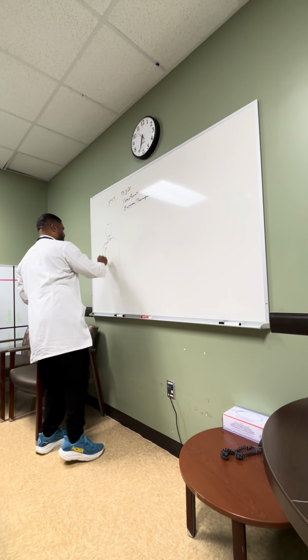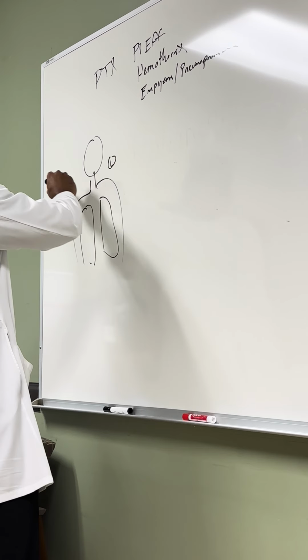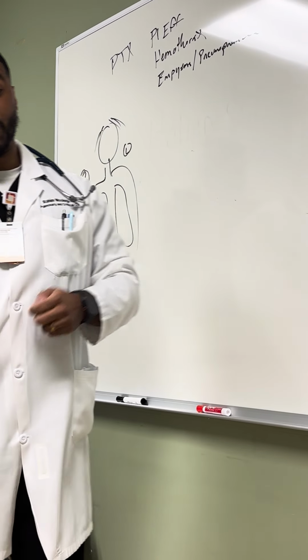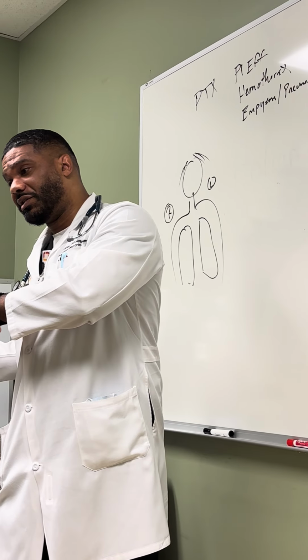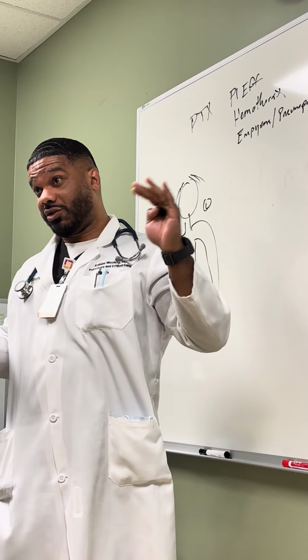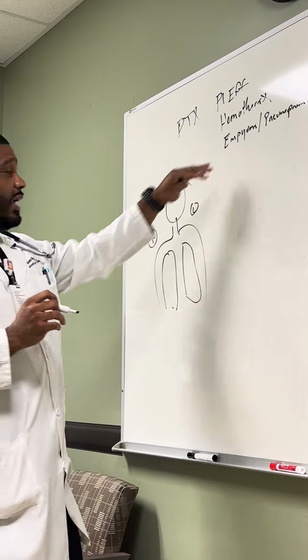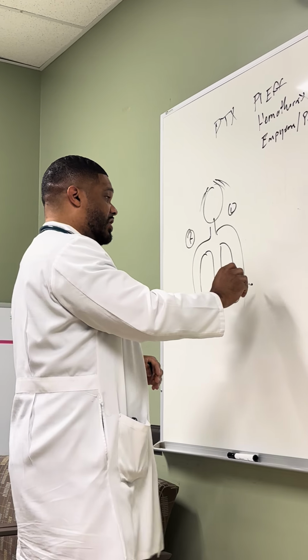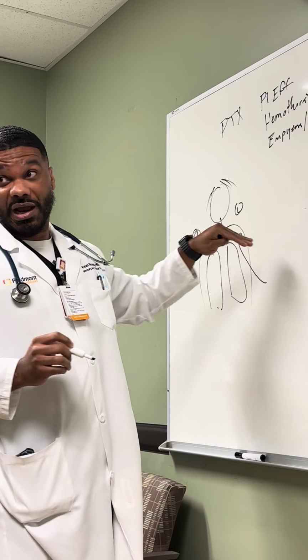So you have your patient, and you have your lung, and we're going to designate this left and right. Pretty patient, okay? So you have your effusion, right? And either one of us from the pulmonary side or the ER gets called to the bedside for one of these issues, and we go to place a chest tube. Really, our goal is to resolve whatever is going on. So if we have a pneumothorax, air rises, so what we want to do is place a chest tube that goes a little bit higher up, because air rises and we're going to catch everything there.